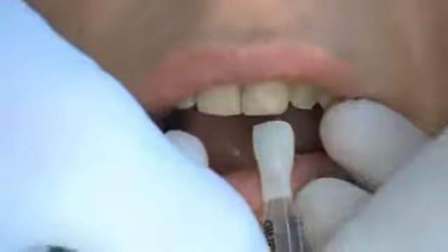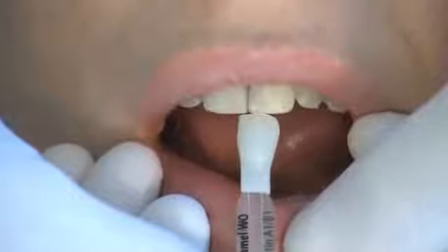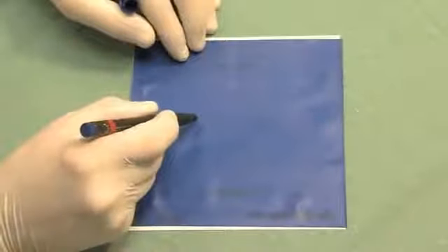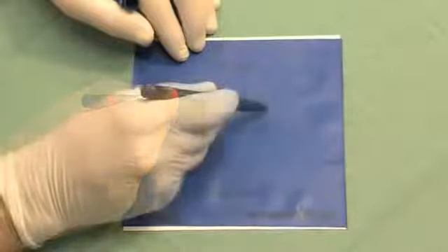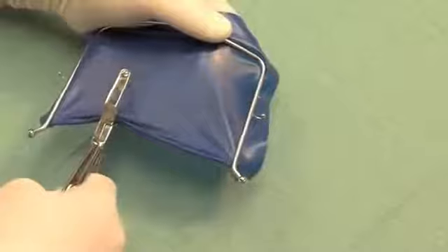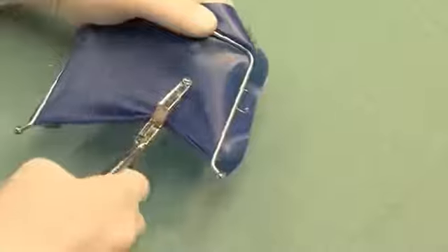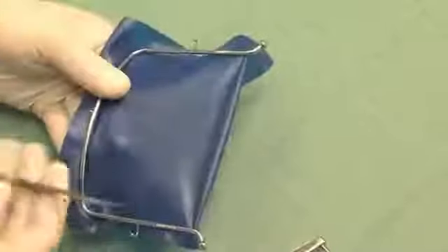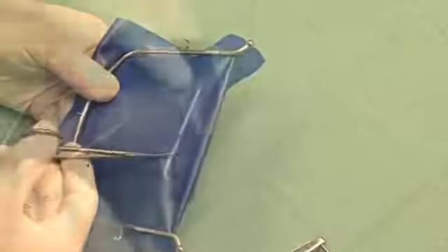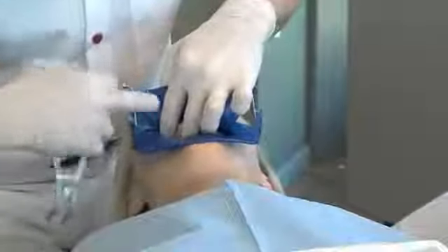Using the rubber dam in the traditional manner, the hole positions are marked using a template, then the rubber dam is stretched over the frame and punched. The dental arch can also be cut out to give a better gingival overview. The prepared rubber dam is placed over the dental arch and fixated distally by clamps.